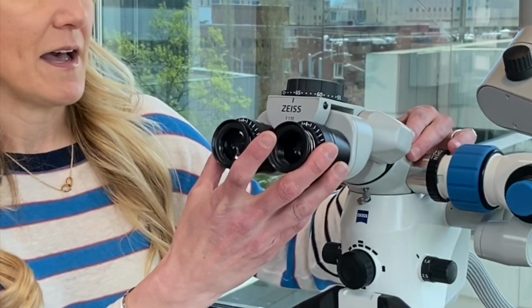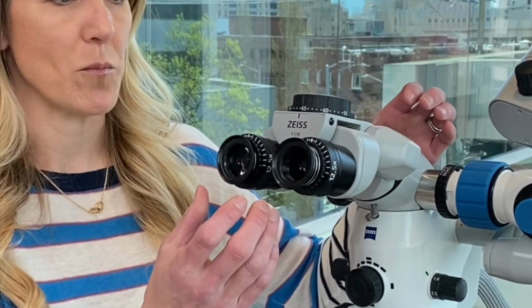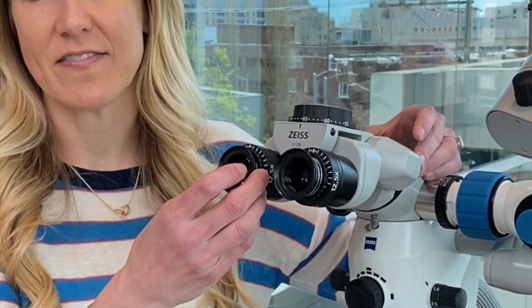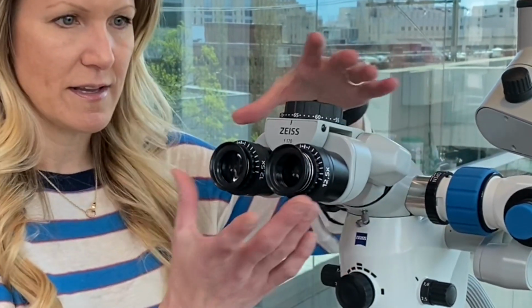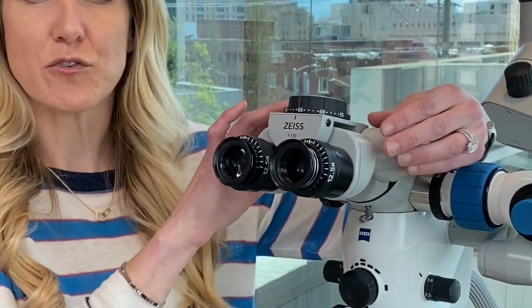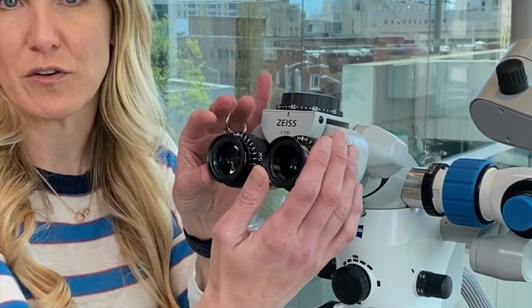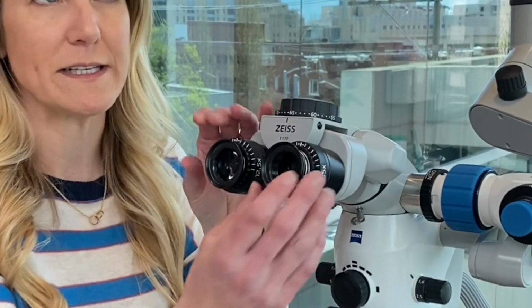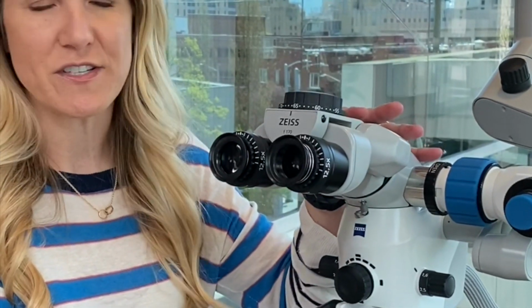So let's focus first on the binoculars and this concept of stereo vision. The binoculars are actually like two telescopes or two microscopes. They each have a lens and a set of prisms in them that allow you to view down through one objective lens. These prisms orient the image so that what you see coming through in your eyepieces is upright and oriented correctly relative to what you're seeing.